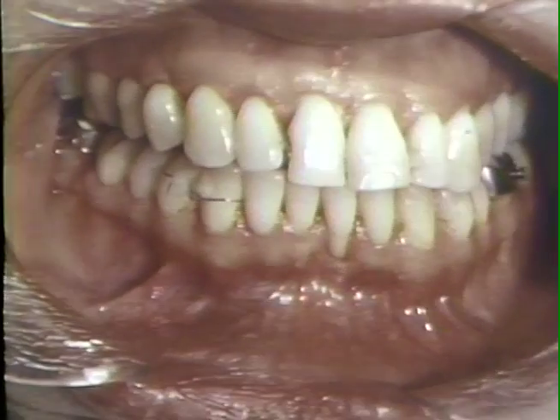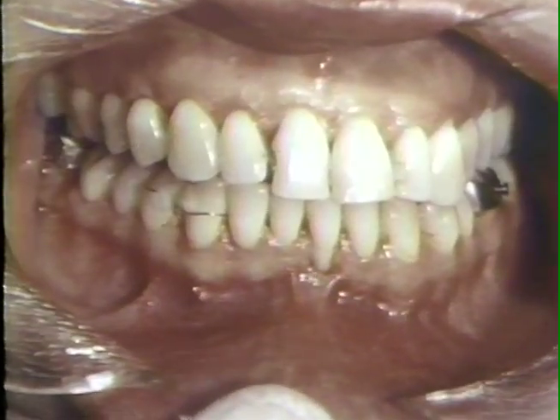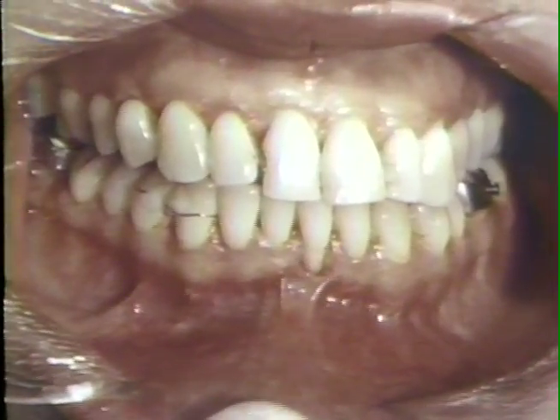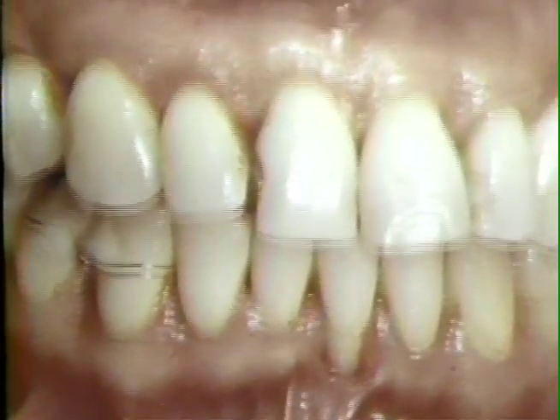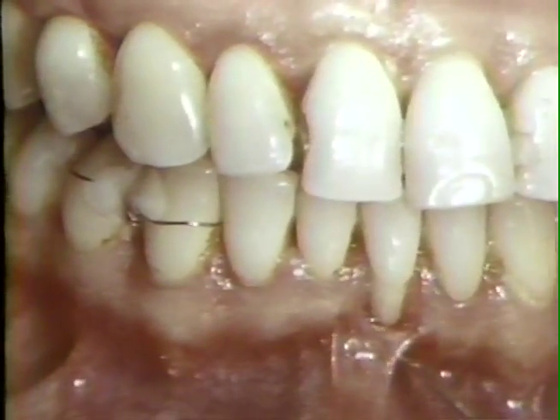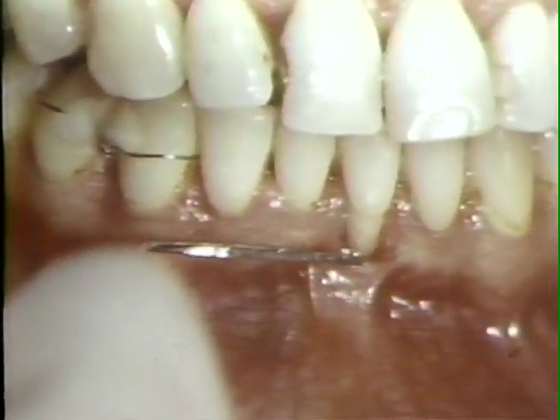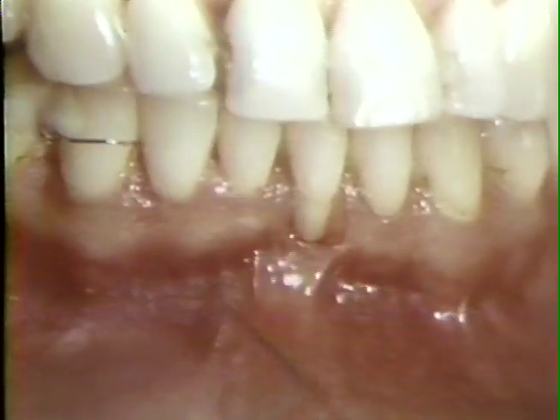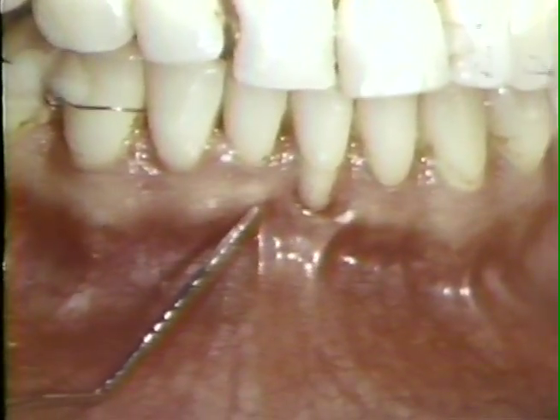This film demonstrates a laterally positioned flap to cover the denuded root of a mandibular central incisor. There is recession present with loss of attached gingiva. The probe indicates that the gingival margin is made up of alveolar mucosa, which has retracted from the tooth surface. The inferior labial frenum continues to pull on the mucosal margin.